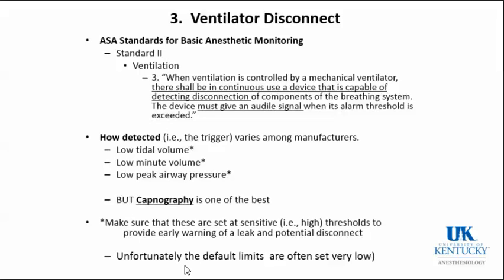Probably, however, besides these machine monitors of disconnect, capnography is one of the best. As long as you're watching it, and as long as you have alarm set on your capnography, this is probably our most sensitive monitor of disconnect.